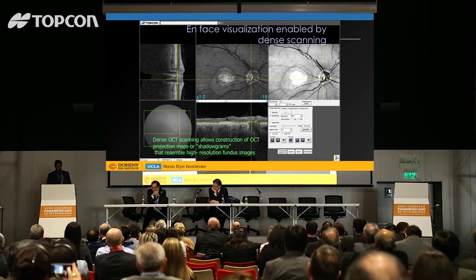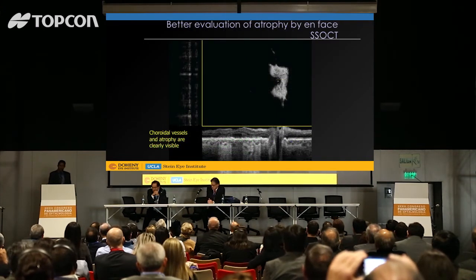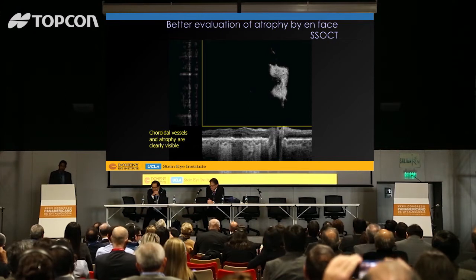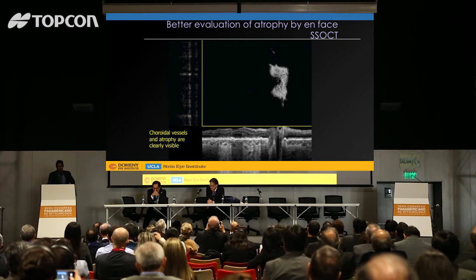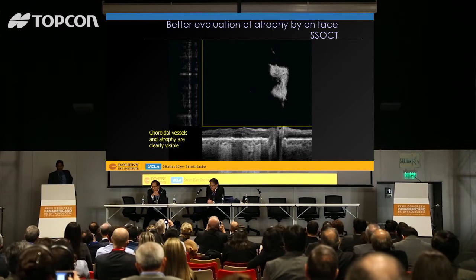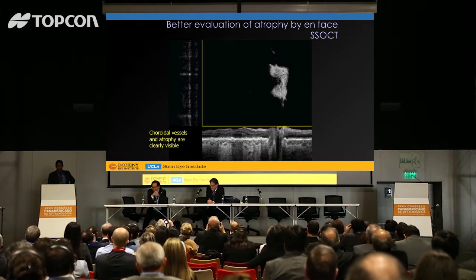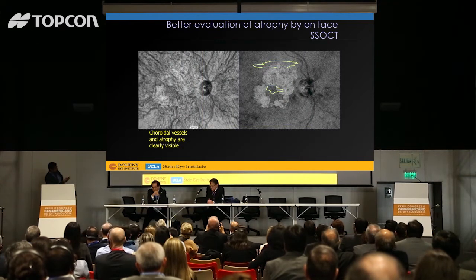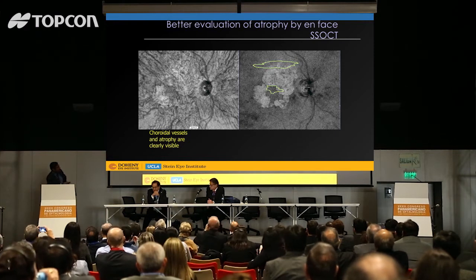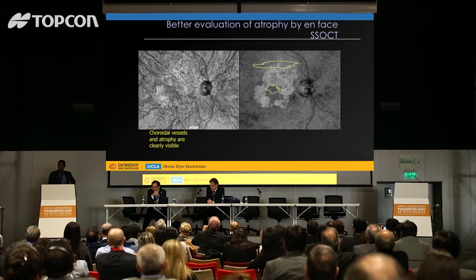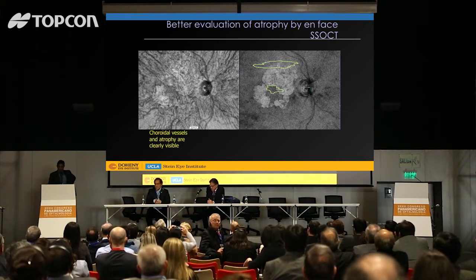When you do high-speed scanning and acquire very dense scans with little separation between them, you can generate OCT projection images that start to resemble fundus images. There are certain diseases where we benefit from visualizing OCT data this way. One of those entities where we're finding an important advantage is in studying atrophy. I've had the great pleasure of working with Dr. Spade in efforts to develop new approaches to classifying and quantifying atrophy. Many software algorithms utilize the OCT projection image to the choroid as a tool for evaluating atrophy, but you can do even better with swept source OCT because of such deep penetration into the sclera.